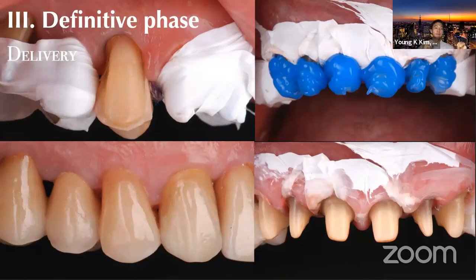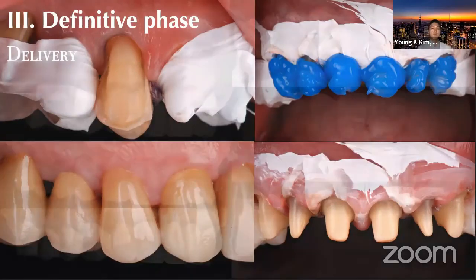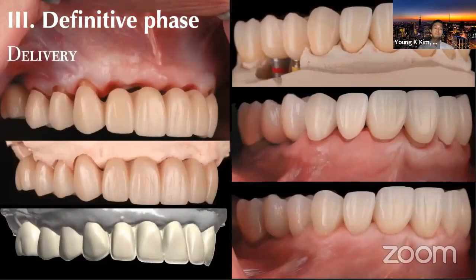And the beauty of the Teflon tape, if you roll it in the subgingival regions, after cementation, you can re-roll it out, and then this becomes a sort of floss, and it can give you a cleaning aid as well after cementing the crown. So I personally prefer to use Teflon tape a lot. But you can create your own techniques. That's the beauty of prosthetics.